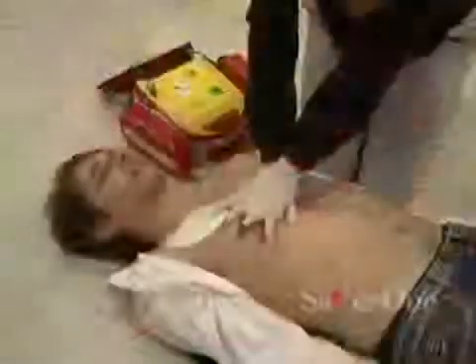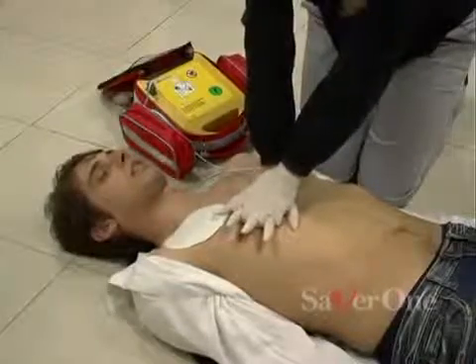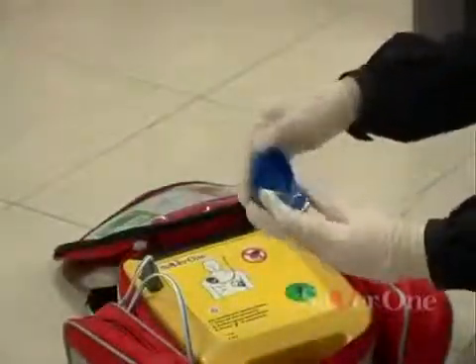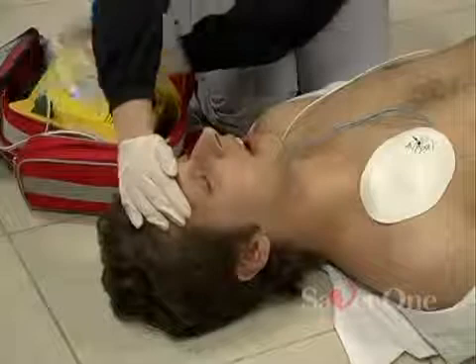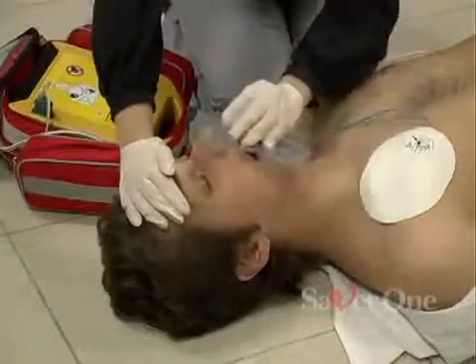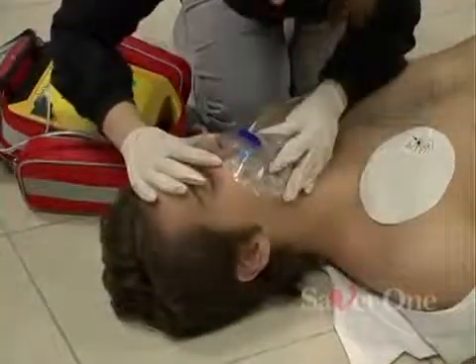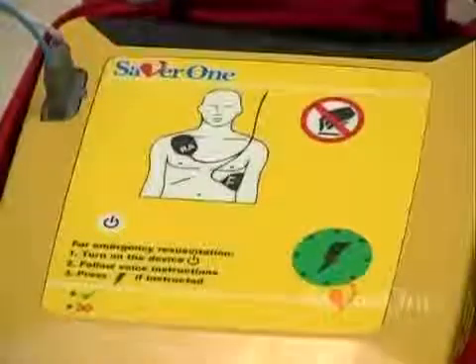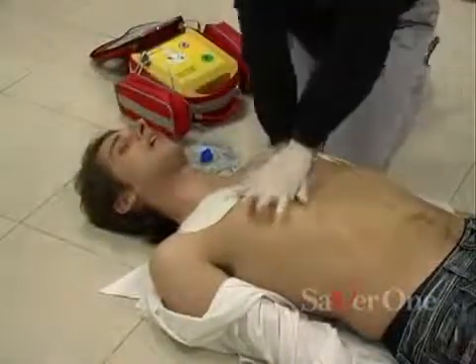Press the patient's chest down fast. Give two breaths. The device will assist the rescuer throughout the CPR, then it will analyze again the ECG of the patient to check his state. Go on with the CPR until professional rescuers arrive.